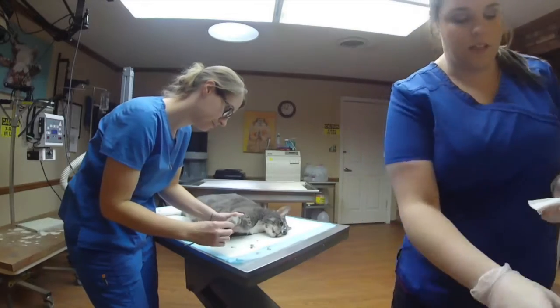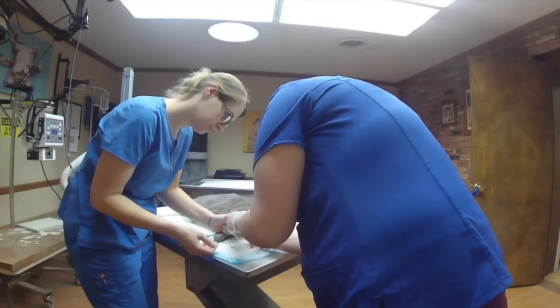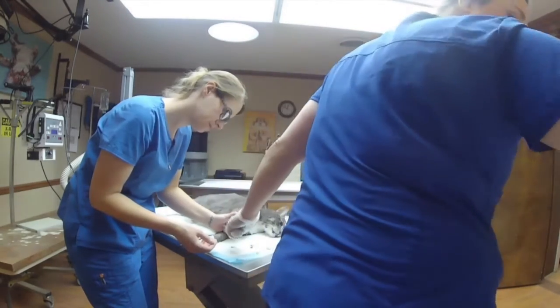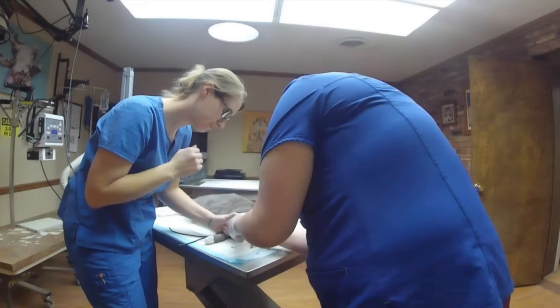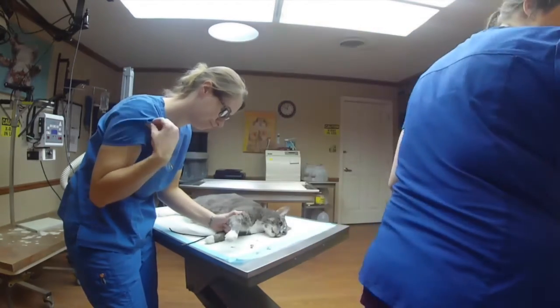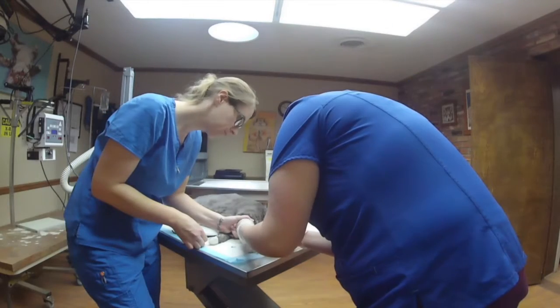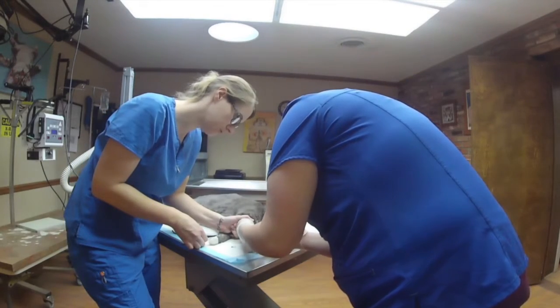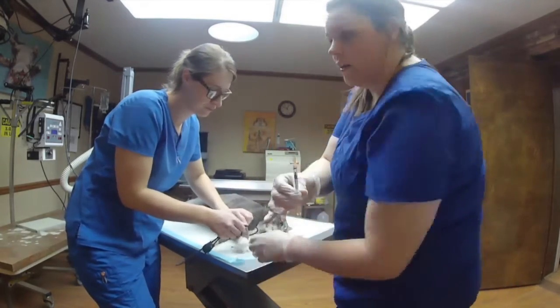We shaved the leg. That way we can fill the vein good. Cleaning it with iodine. And then go over it with alcohol. I have a TB syringe. Got it. And that is how you draw blood on a cephalic vein.